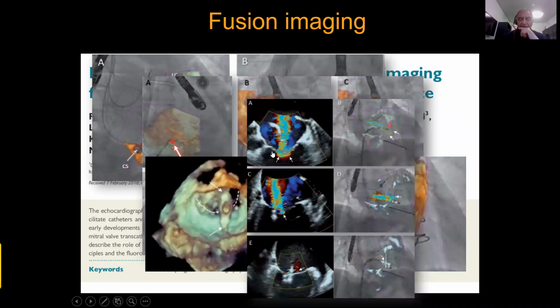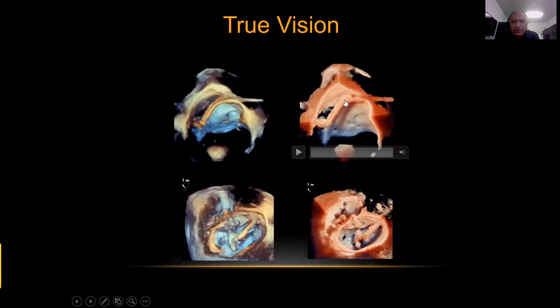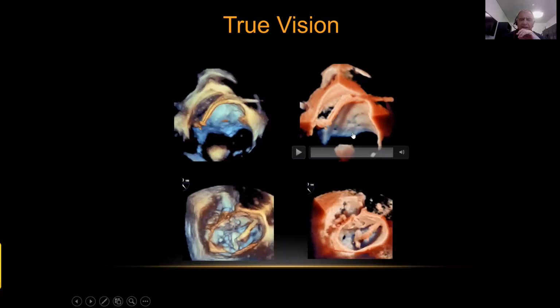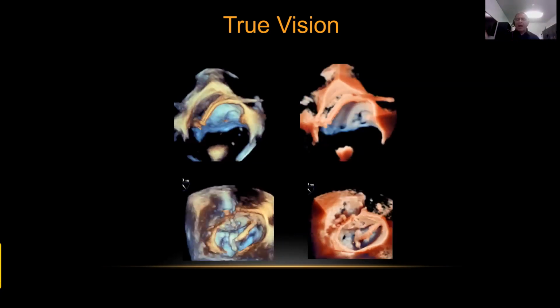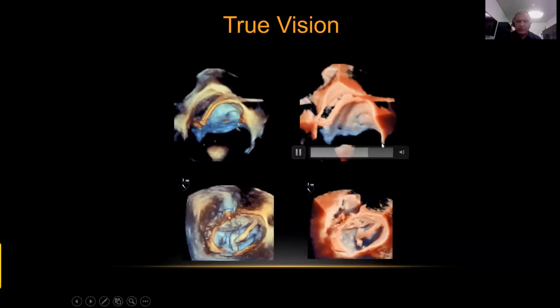For example, we can see the color Doppler in fluoroscopy for the first time. We can see the regurgitation without contrast in fluoroscopy, and then you can just put the catheter on the hole of the mitral regurgitation. And now we have another, called TrueVision, which is very interesting, in which you can look at the 3D images from different points of view. This is really very interesting, and we will discuss this too.